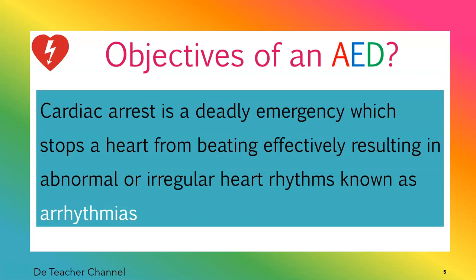Cardiac arrest is a deadly emergency which stops a heart from beating effectively, resulting in abnormal or irregular heart rhythm known as arrhythmias. So cardiac arrest can push a heart into an abnormal or irregular state, and that will lead to abnormal rhythm known as arrhythmias.